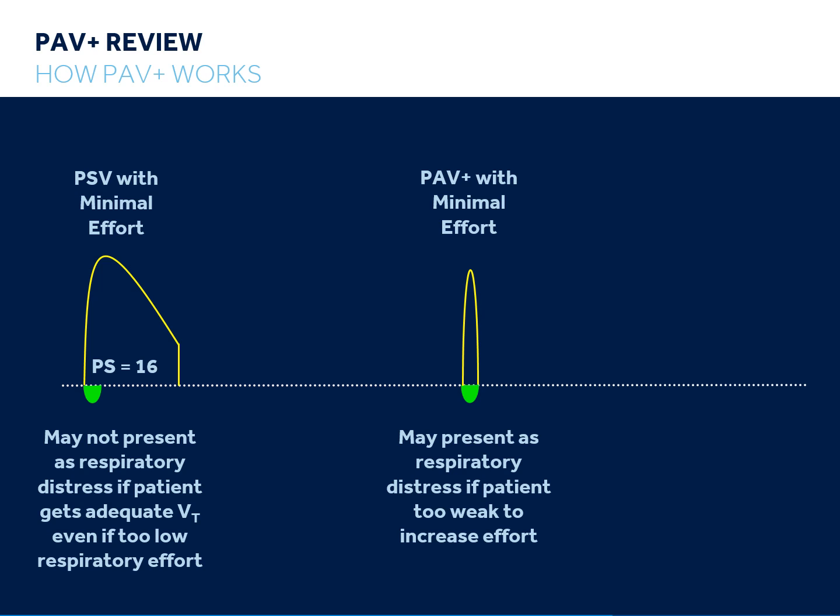In these cases, where even high levels of PAV percent support seem inadequate, consider resting the patient overnight, possibly on pressure control, ensuring that absolutely no distress or accessory muscle use is noted, and try PAV again the next day. It may take several days of trying for such a patient to tolerate PAV for long enough to get started on the prolonged weaning protocol.